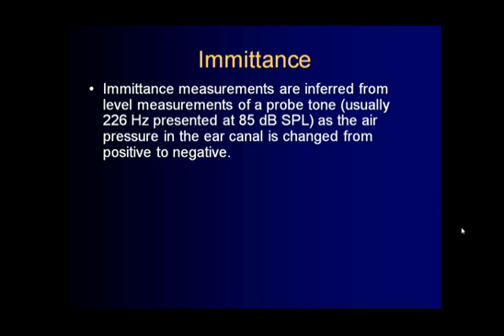We're actually going to force air into the ear canal, and we're going to take air out of the ear canal. We're going to change the pressure from a positive air pressure to a negative air pressure. And we're going to answer the question, how does the level of the probe tone change as we push air in and take air out of the ear canal?